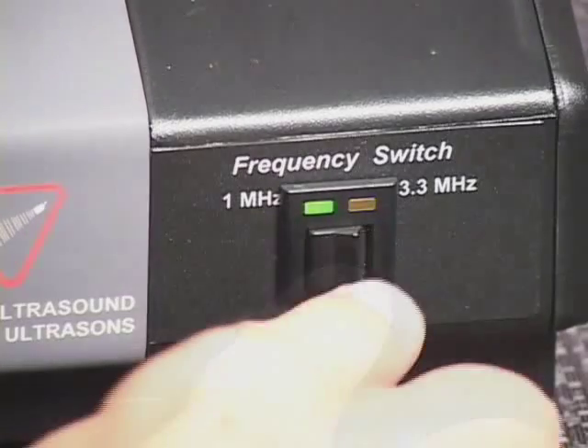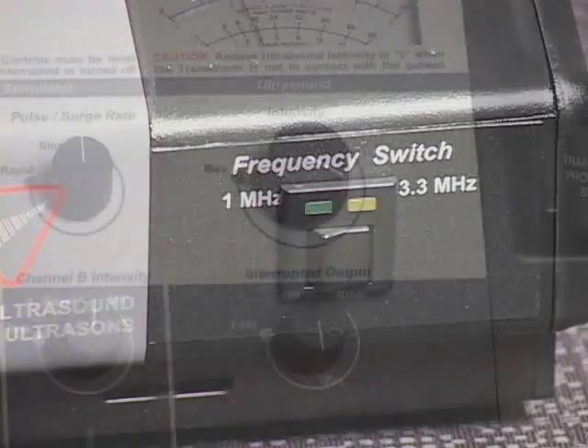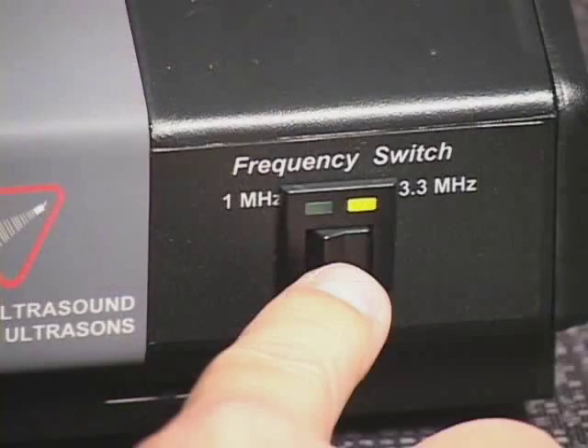If the ultrasound frequency switch setting is changed during treatment, ultrasound output will be discontinued immediately and the selected ultrasound frequency indicator light will flash. Ultrasound output cannot be resumed until the ultrasound intensity control is returned to the zero position. The selected ultrasound frequency indicator light will cease to flash and remain illuminated. Now ultrasound output can be activated.